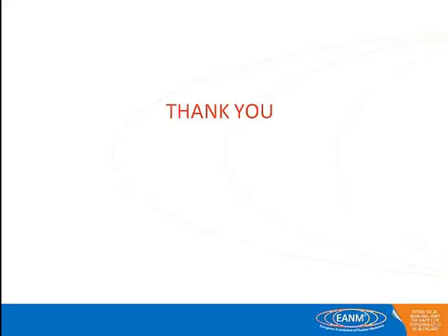But if you have a big CT with diagnostic CT on site with a dedicated PET, then you can do the CT as well as the PET for the management of the patient. Well, you can really have a full schedule for the patient. In one session, you can have a good, confirmed diagnosis and planning for radiotherapy. It's possible. With some effort, we could also do it in our department.